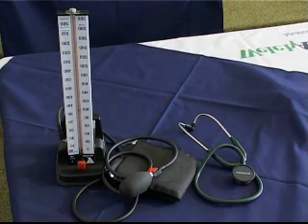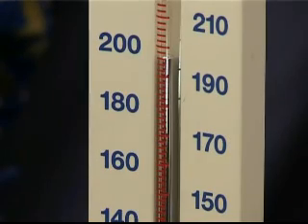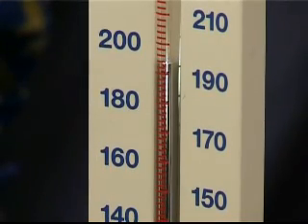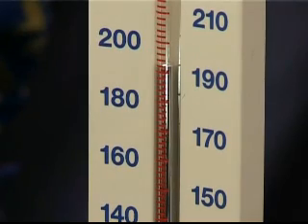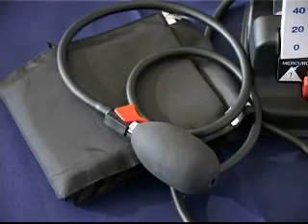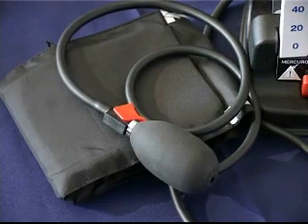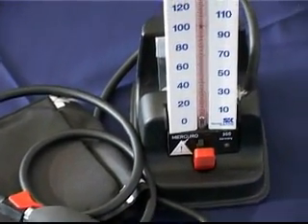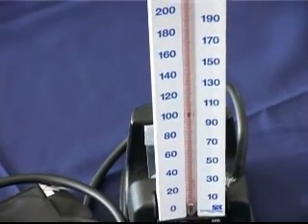The mercury sphygmomanometer is also known as a bowmanometer. It consists of a mercury column marked in millimetres of mercury graduations from 0 to 300 mmHg. It is normally supplied with an adult blood pressure cuff, tubing, and an inflation bulb with an air flow control valve.